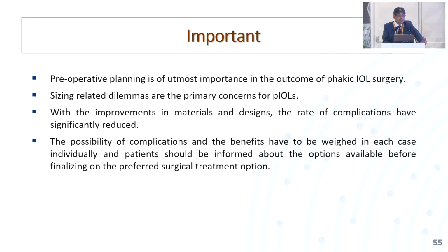But the important thing to be kept in mind is that pre-operative planning and workup is very, very important, and sizing related dilemmas and issues are always there. With the improvements in material and design, the rate of complications has significantly reduced.